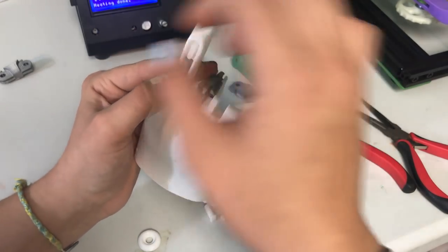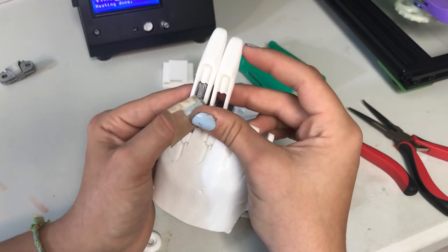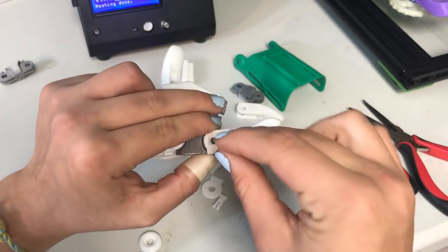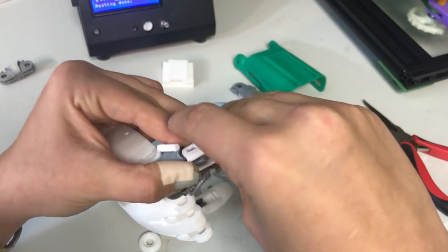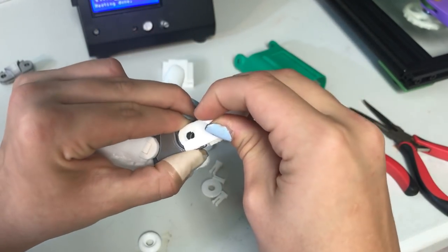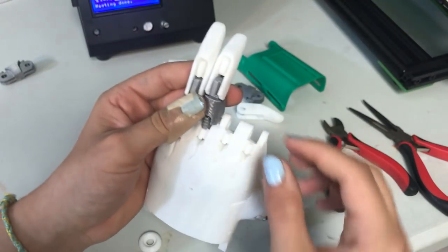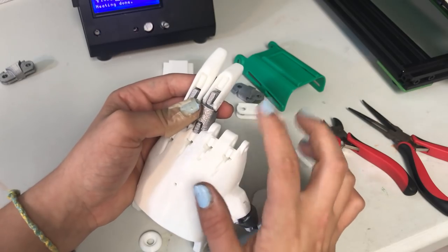I also forgot that there are two different size fingers. As you can see, this one is shorter, so you want to use the pinky one on the pinky. Make sure you do that correctly. Find the right spot to put the peg in — I do sometimes put it in the wrong way, which means I have to take it out with some pliers. Just push it in there and make sure you hear it click. Once the other one is done printing, then I'll do this side also.